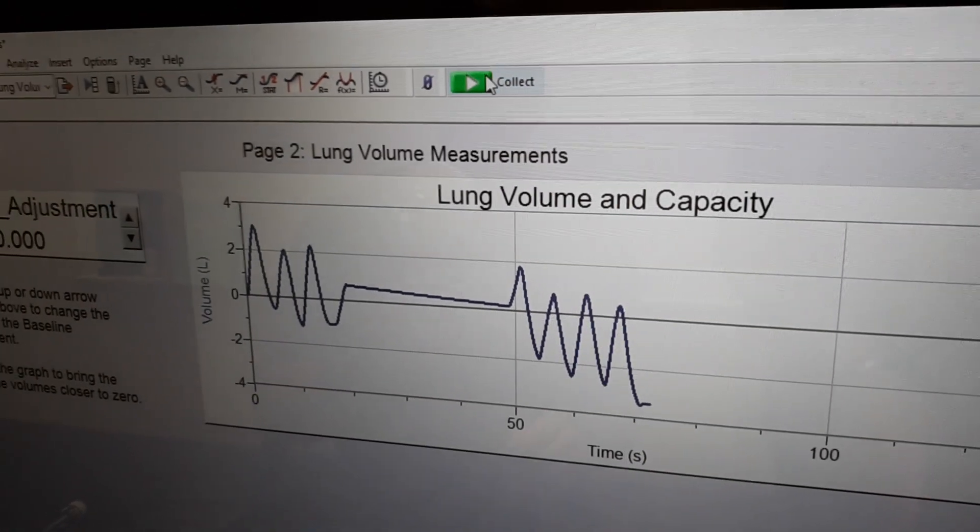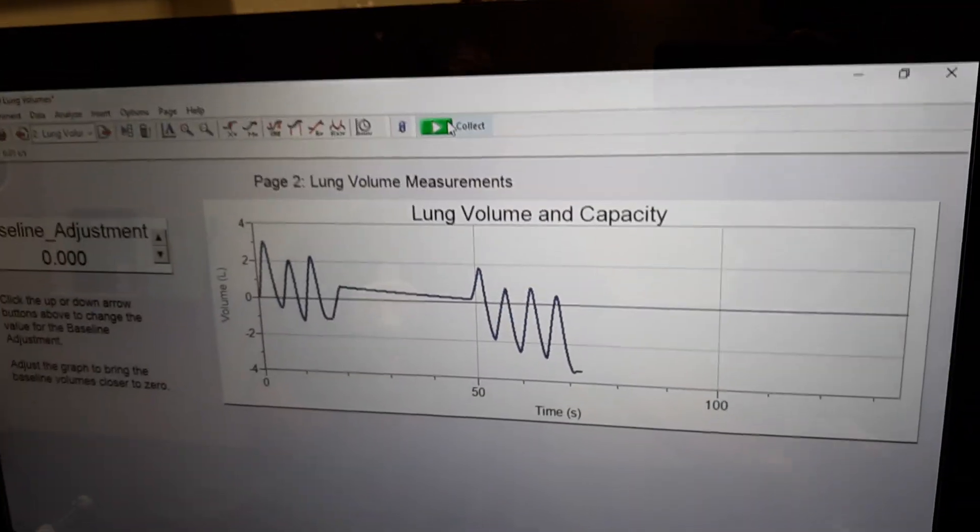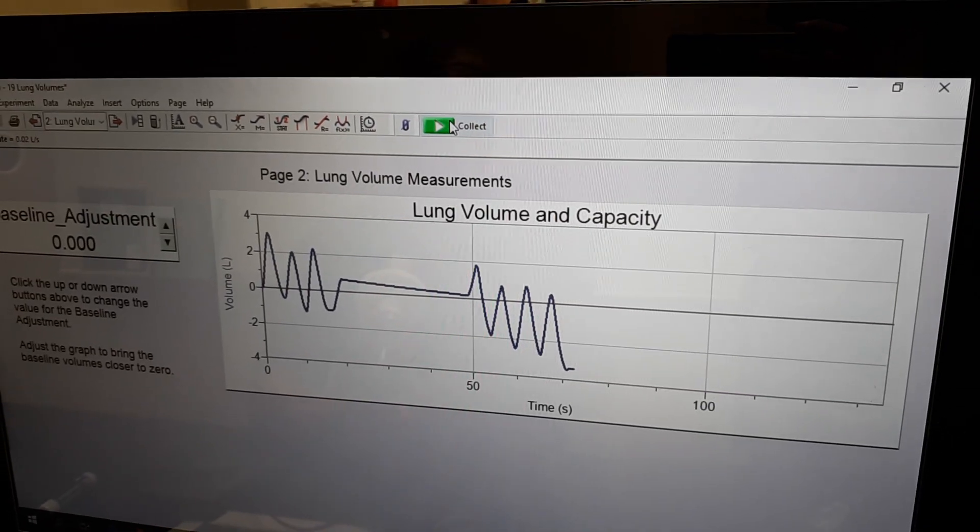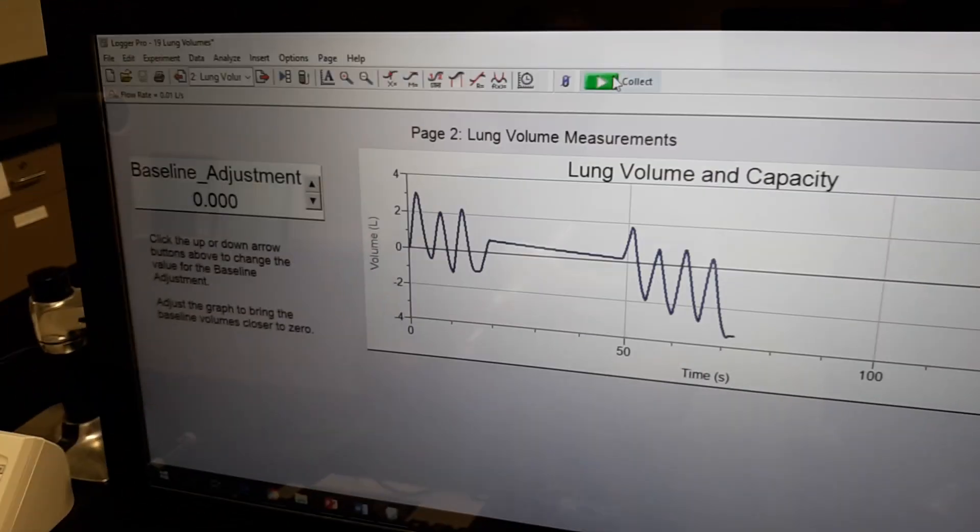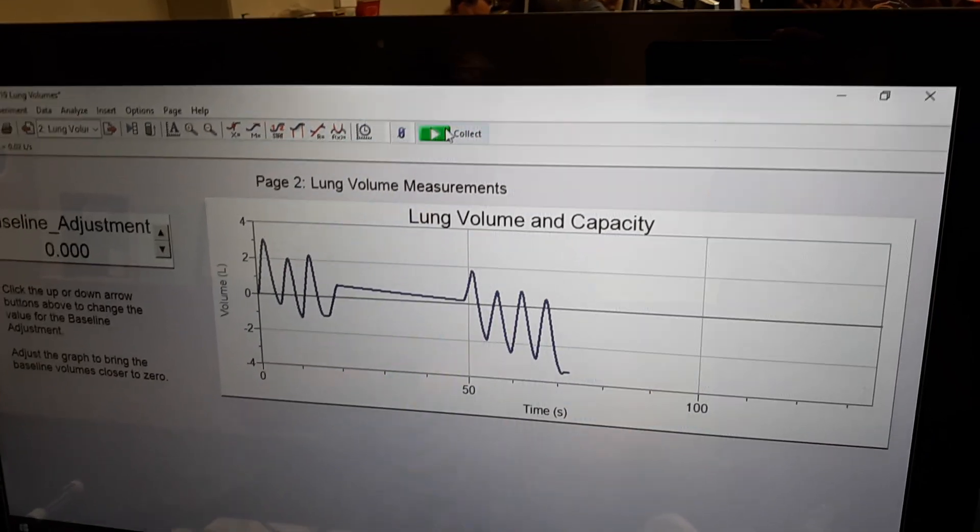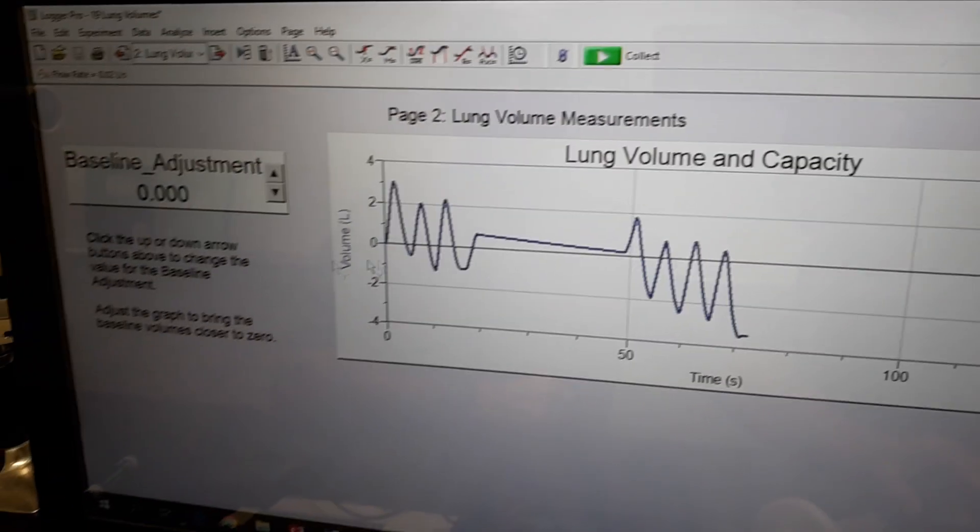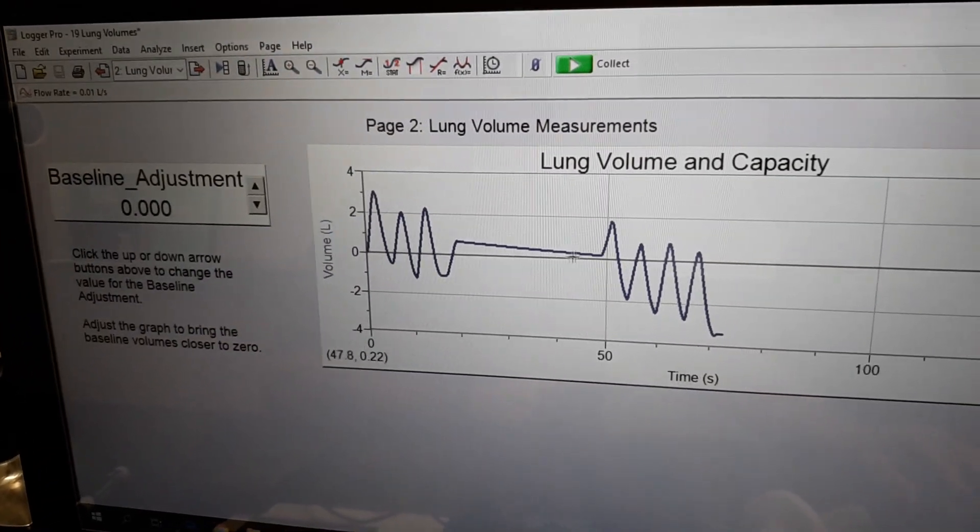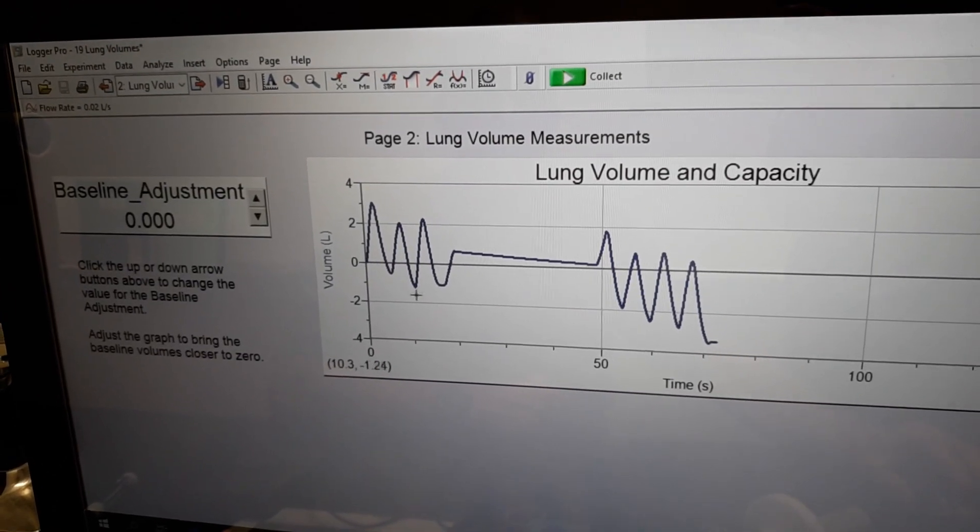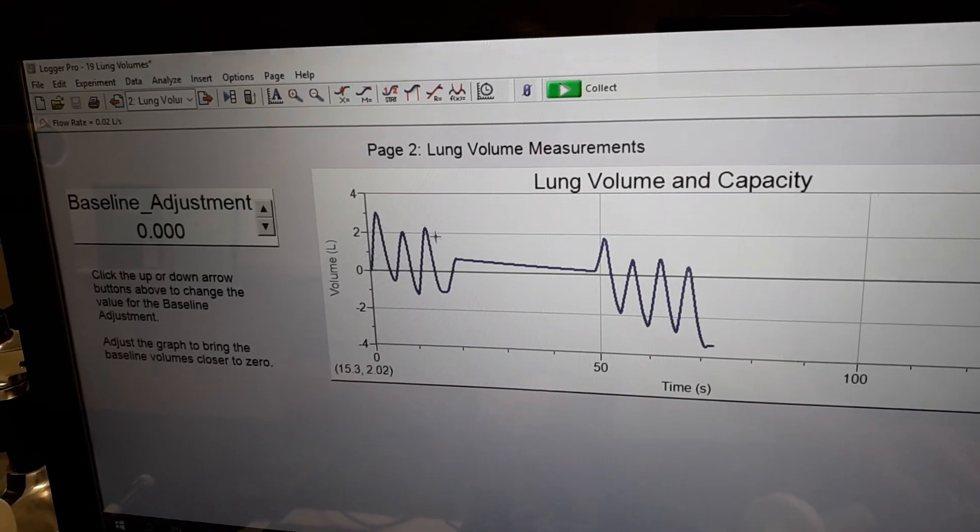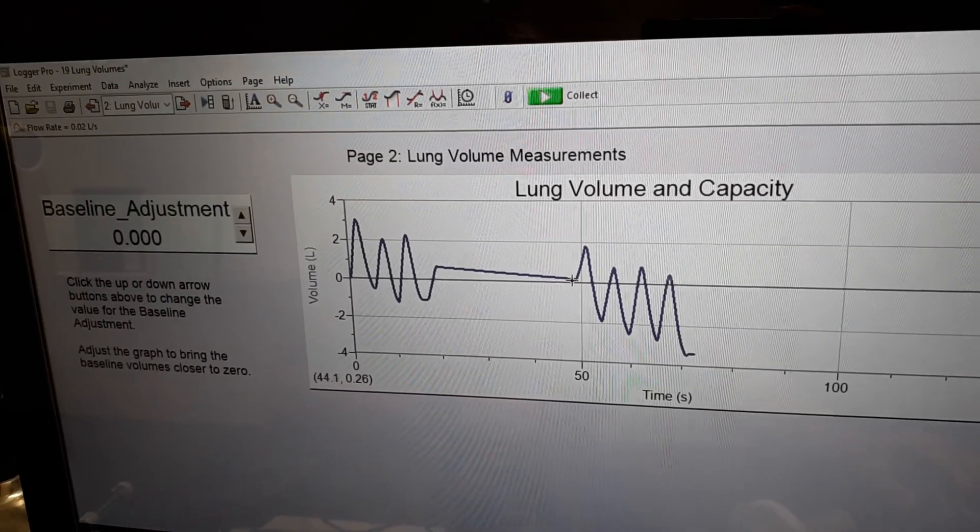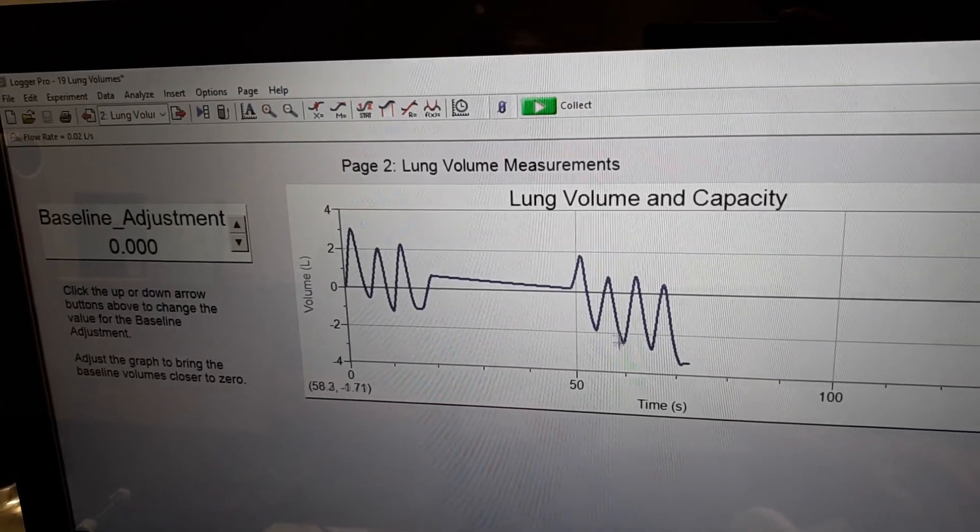All right and once you get that fourth breath your partner can hit the stop button. You can remove your nose clamp, set your spirometer just down on the table, and you can take a look at what we've got here. So you should have a nice graph that looks pretty similar to this with some waves here. We've got some peaks and valleys and then a long pause and then again peaks and valleys here.